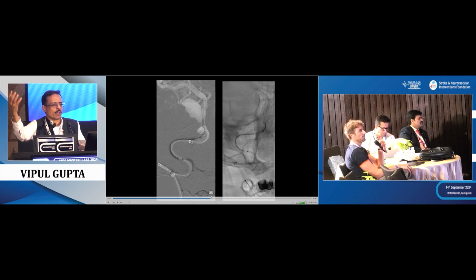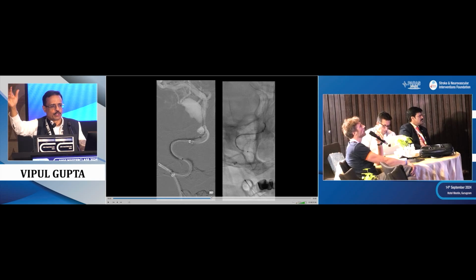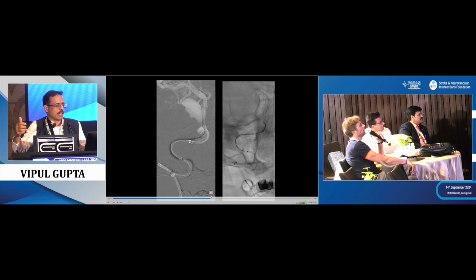So what he's saying is, one view may look fine like a straight artery, but in the other view the curve is such that the catheter, when it comes to this area, twists a bit, and it's a long stent, and the microcatheter twists a bit and rotates the stent. And I changed the stent. I threw out one stent, used another one, whatever I could do.